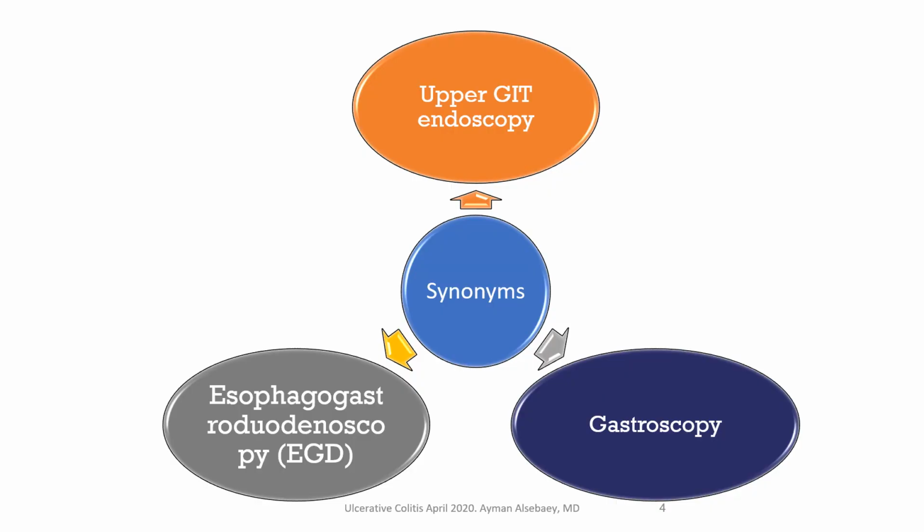You should know that there are synonyms. Upper GIT endoscopy is the same as gastroscopy, is the same as esophagogastroduodenoscopy, EGD. They are the same.